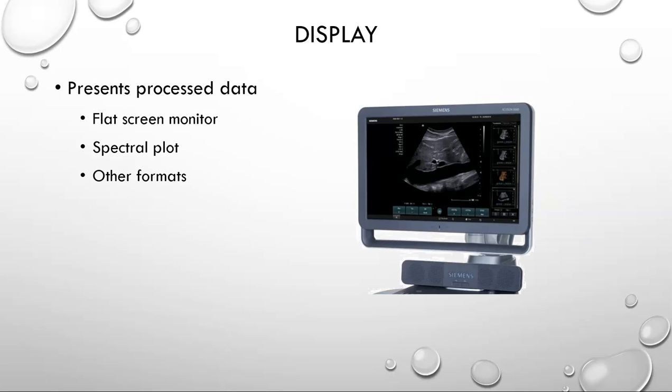After the receiver, the information is sent to a scan converter where it is processed for display, and then onto the display, which is typically a flat screen monitor today. There's several other formats that it could be, but this is the most typical in today's systems. We'll talk a little bit about flat screen monitors in a bit here.